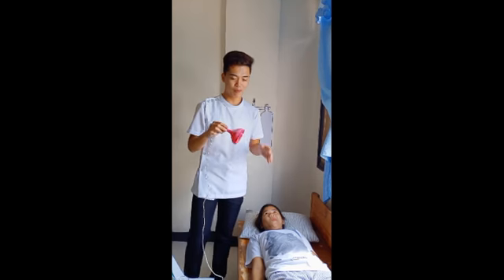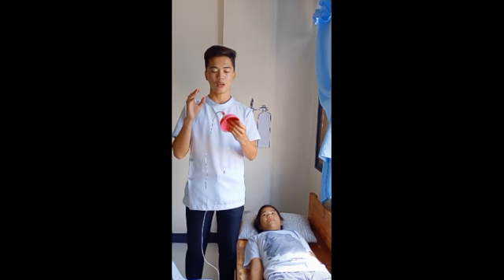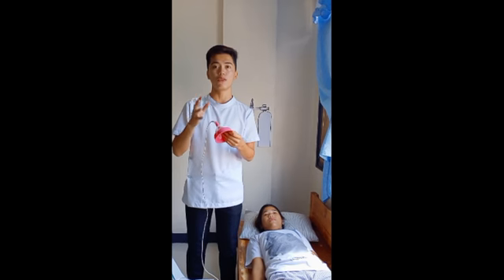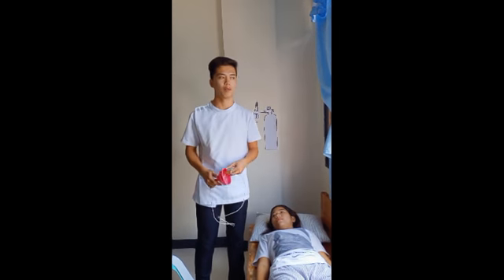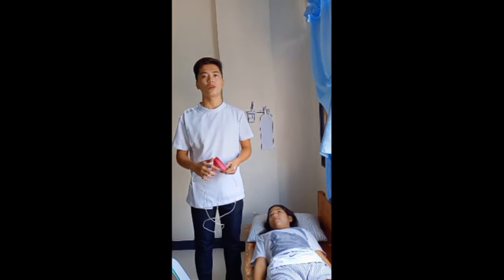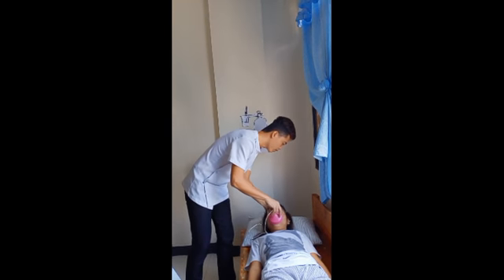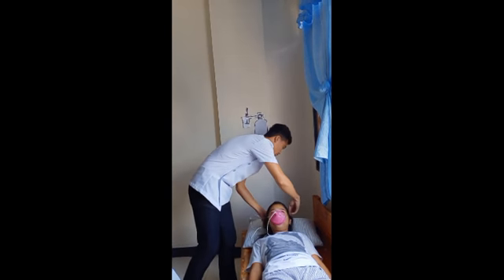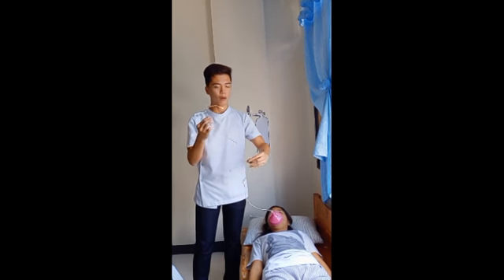We use this simple face mask for patients with difficulty breathing. So you need to fit the mask on the client's face, the patient's face, just like this. This one is the tubing.